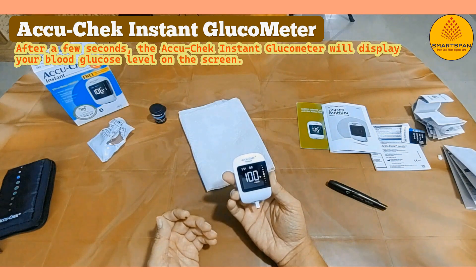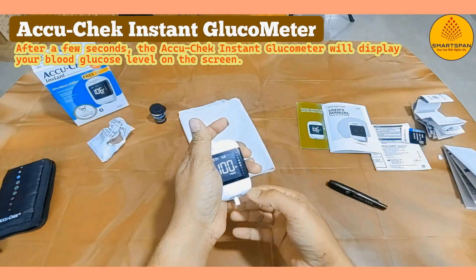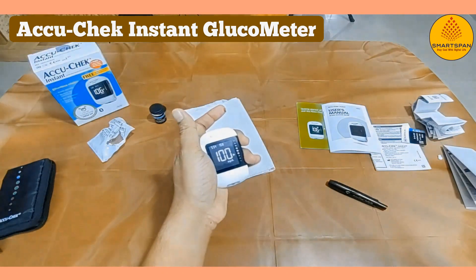After a few seconds, the AccuCheck Instant Glucometer will display your blood glucose level on the screen. Once done, the used test strip can be safely ejected and disposed of.